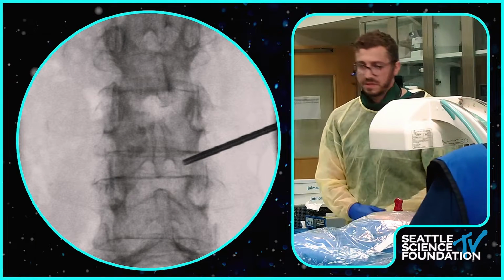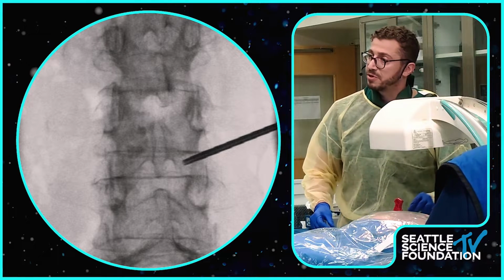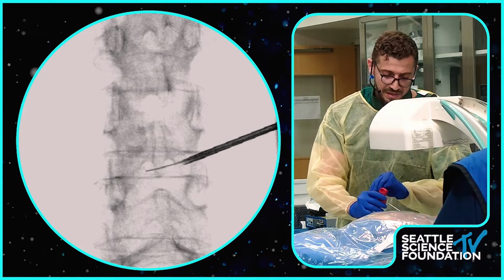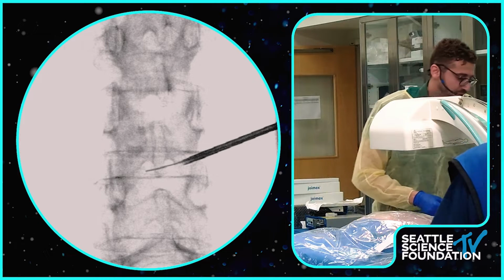Okay, so we're still in the right place there. I'm just going to X-ray. I pushed in the spinal needle deeper than what we usually do, just to make sure that everything stays in place. Okay. All right, so now we'll do the reaming.